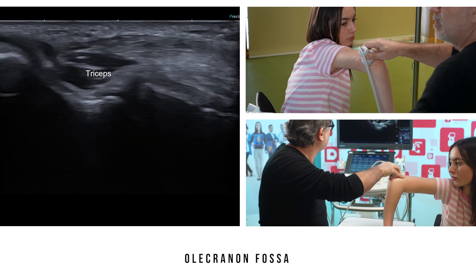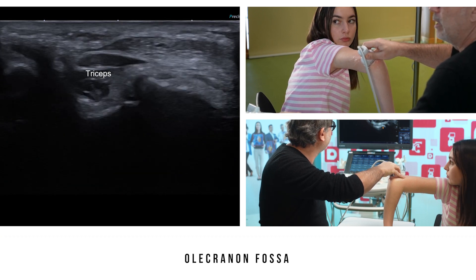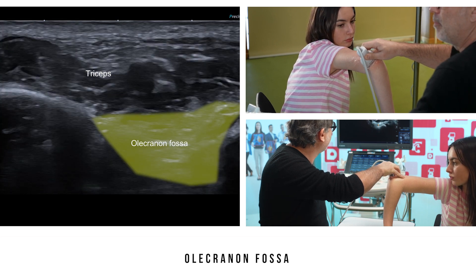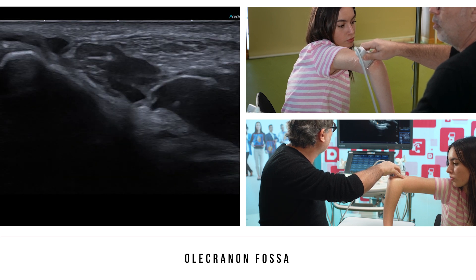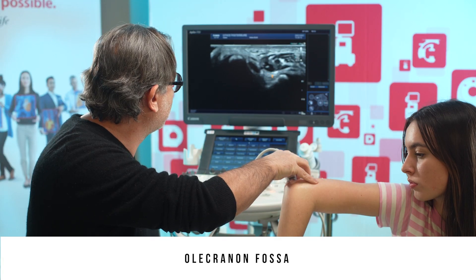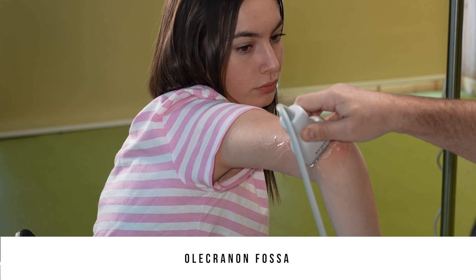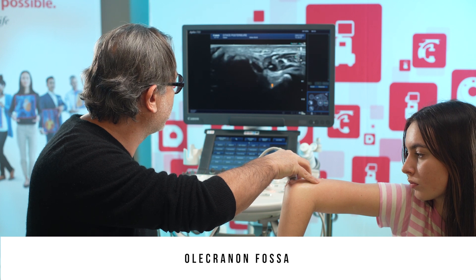Under the triceps brachii, we can see the olecranon fossa, which is mostly filled with fatty tissue that appears hyperechoic. In some cases, you might see this olecranon fatty tissue move a bit because of effusion — this can be a sign of joint pathology or of an occult fracture at the bony surfaces of the posterior fossa of the elbow.